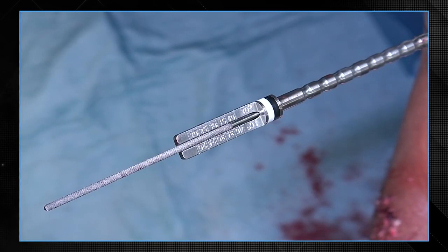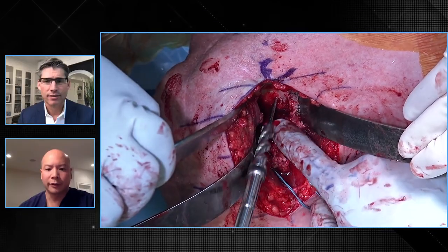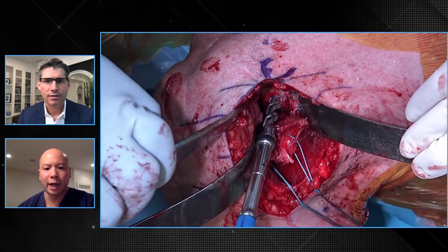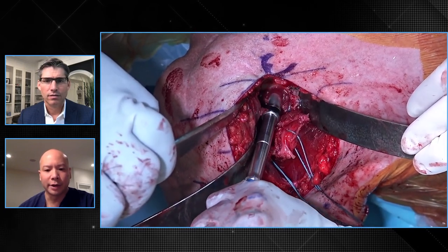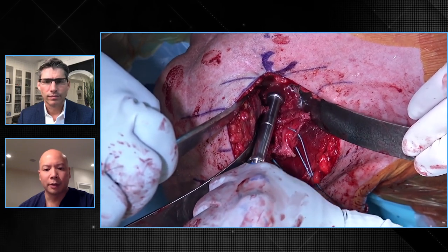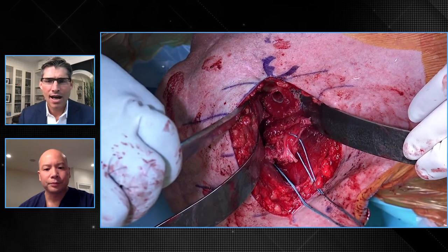Now it looks like you're checking the length of your central post, which we know from your plan was going to be 40. Yep, the VIP plan is pretty accurate in allowing me to do that. You can see this long drill bit for the central post, and we're going to go bicortical with this. I agree — I've gone bicortical for almost all indications, especially if I'm using an augment or lateralizing the center of rotation. I think that's important.